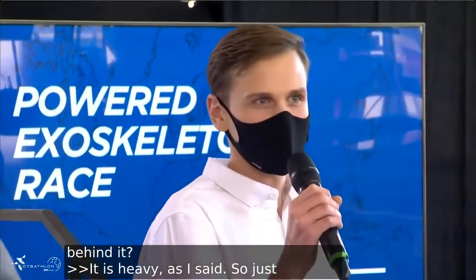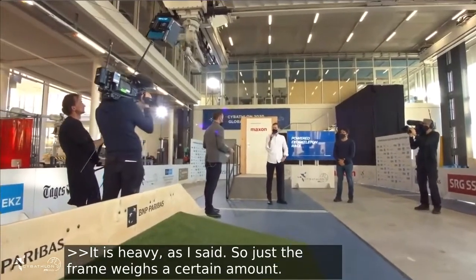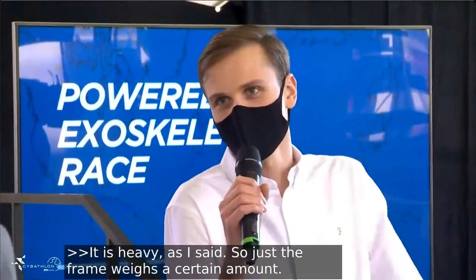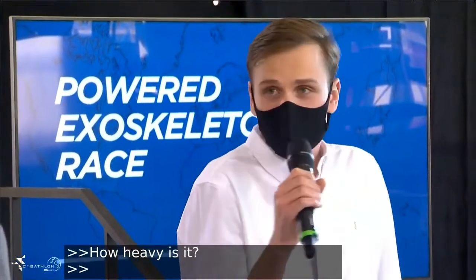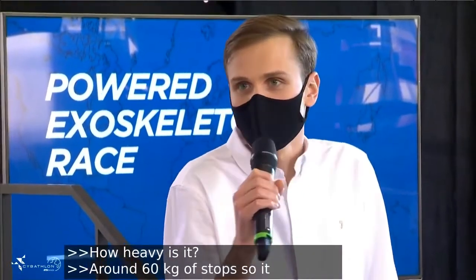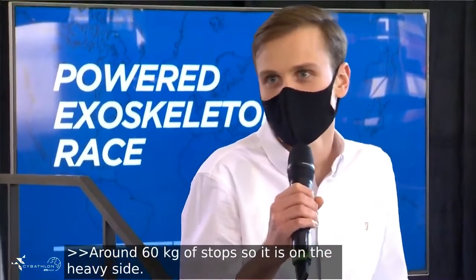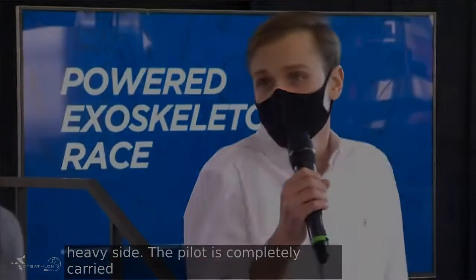How heavy is it? For this one, I'm not entirely sure — I think it was something around 60 kilograms. So it's rather on the heavy side compared to the other devices. But the good thing is, since the pilot is completely carried, there's no load on the upper body. The weight of the whole device will not be transferred to the upper body.